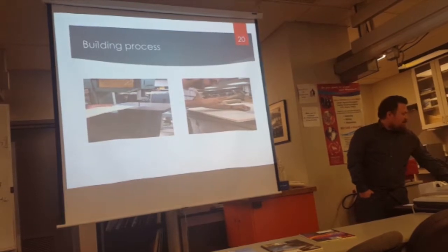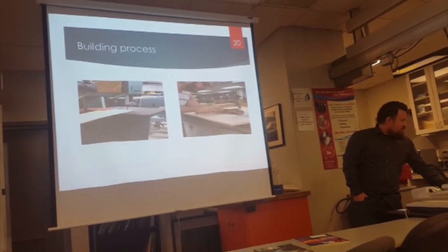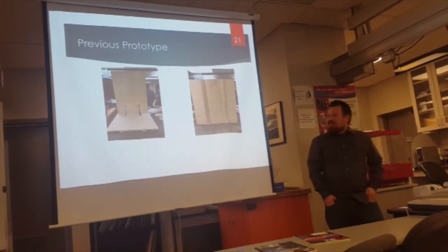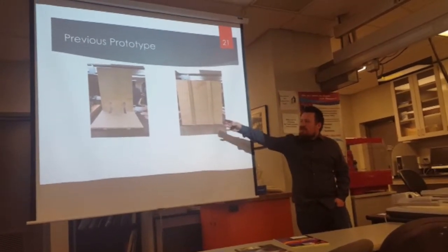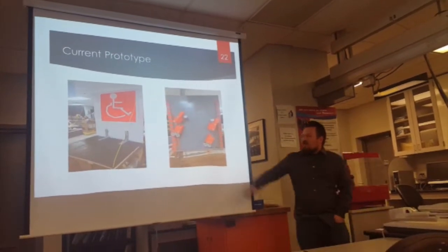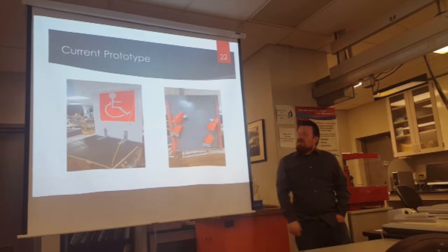This is just how we went about building — cutting and attaching and securing all the parts of the lift together. This was the original prototype that we had before any adjustments were made: just a simple skeleton on the bottom, using some L-bars to add extra support. But this is how it is currently at the end of the semester — we added some guide wires to give it more support when weight is added. These are the type of hubs we have, and I'll go into more detail about those hubs in the next few slides.